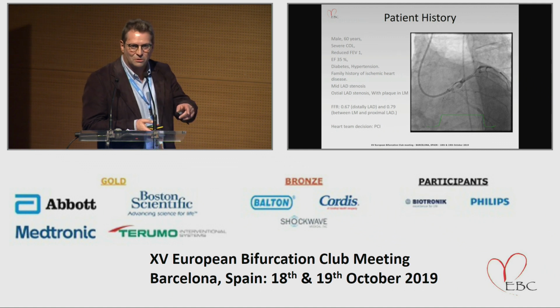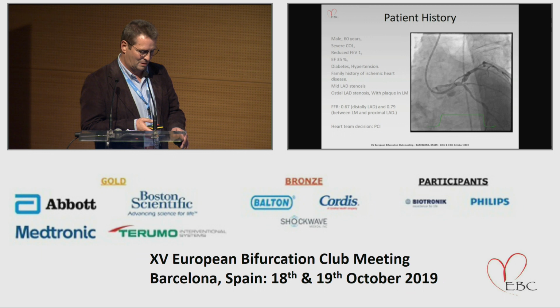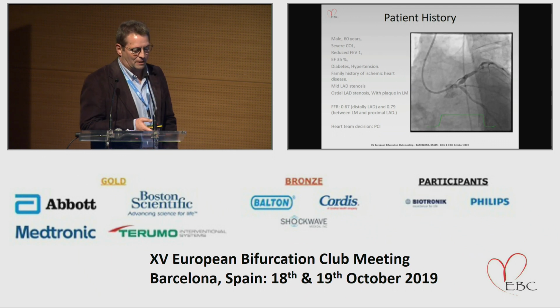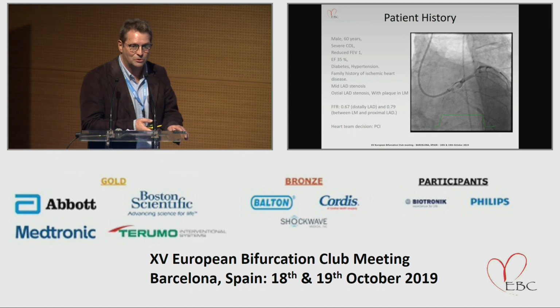I don't know if you could just click on the panel just to let the panel run again, so you maybe could have an idea of the lesion. As you can see, it's an ostial LAD, and there is some disease further down the LAD. We made an FFR, and it showed a pressure drop to 0.67 in the distal part of the LAD, and it increases up to 0.79 just below the takeoff of the LAD. So it's basically significant, but in the gray zone. Anyway, we decided to continue to do the case.